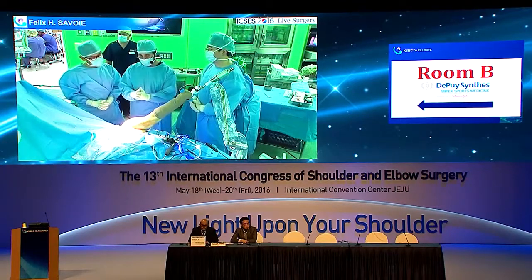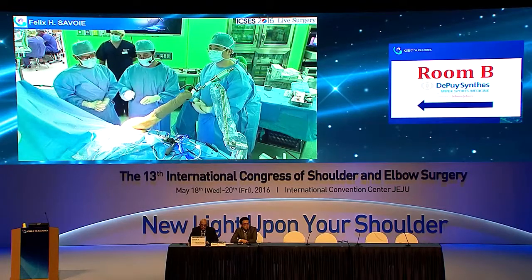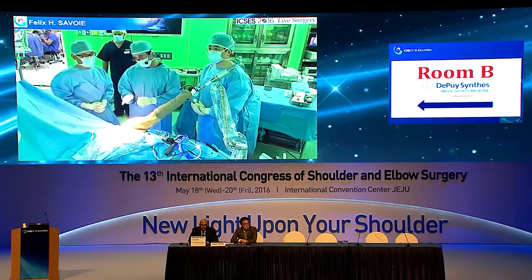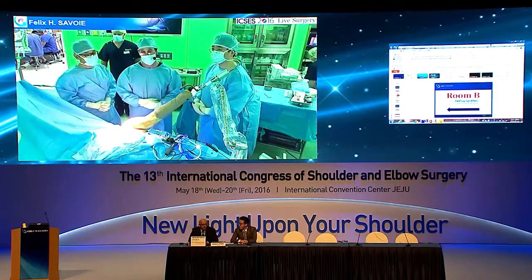It's possible if you really have a layered dissociation, then I would do that. I would repair the bottom row, save the stitches, bring them back through the top row, and lay them down over the top. So yes, there are times when you look in, and apparently that's more common in Japan than it is in the U.S. Thank you.